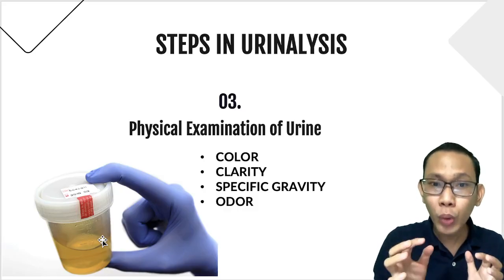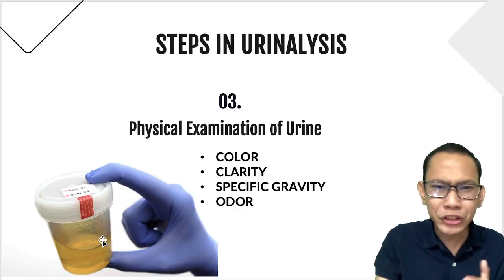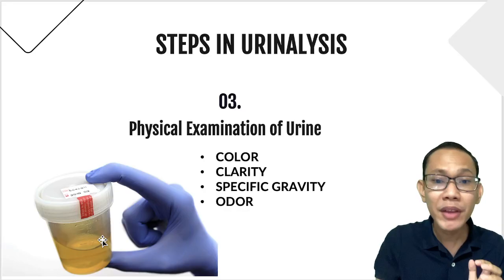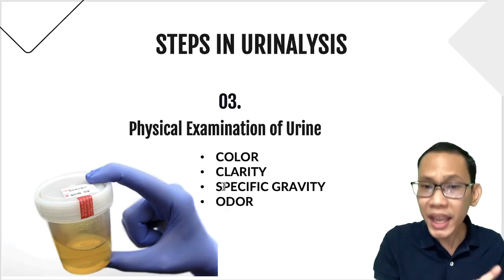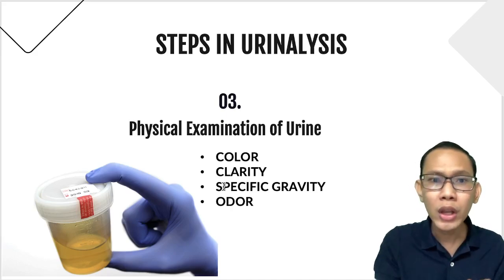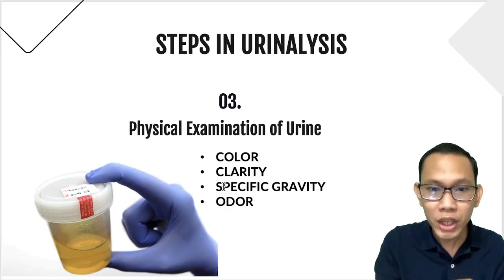For us to avoid such a problem, in terms of na magkakaiba tayo ng interpretation, we will have a specific parameter, most specifically sa clarity, na how can we say that it is clear? How can we say that it's hazy? So, we have certain parameters to follow so that we are able to come up with a similar observation.